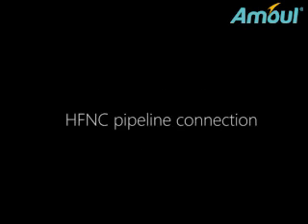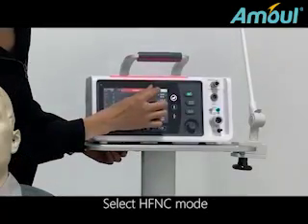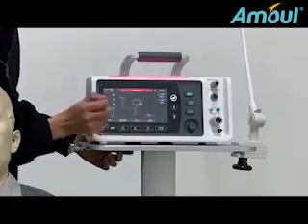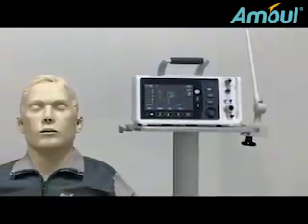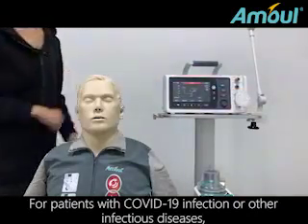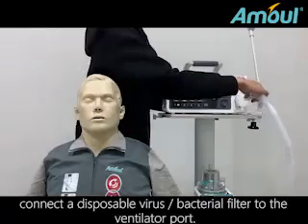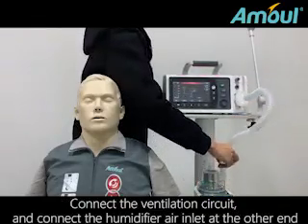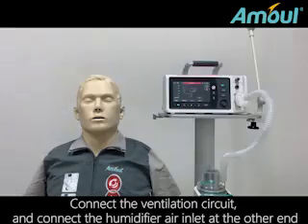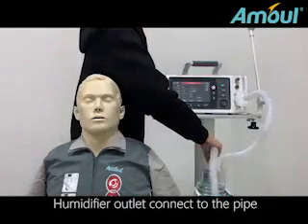HFNC pipeline connection. Select HFNC mode. For patients with COVID-19 infection or other infectious diseases, connect a disposable virus and bacteria filter to the ventilator port. Connect the ventilation circuit, and connect the humidifier air inlet at the other end. Connect the humidifier outlet to the pipe.